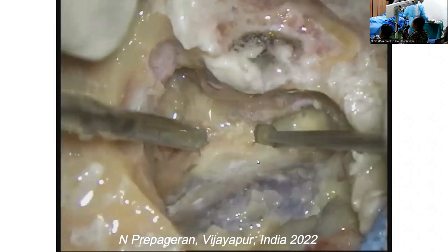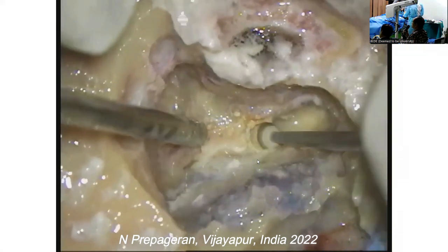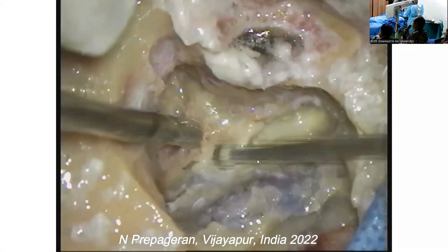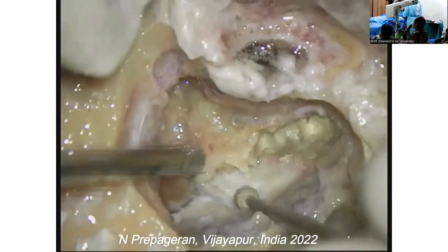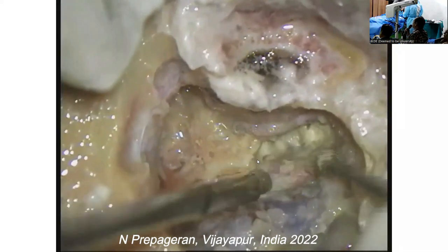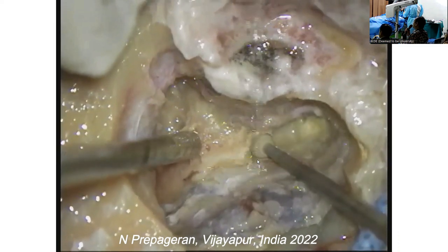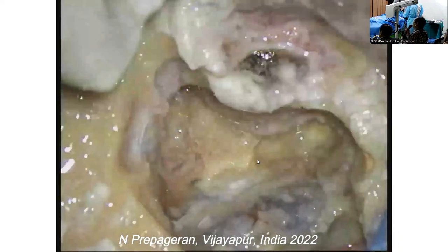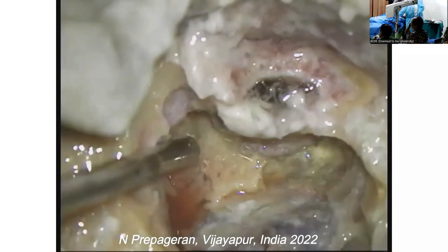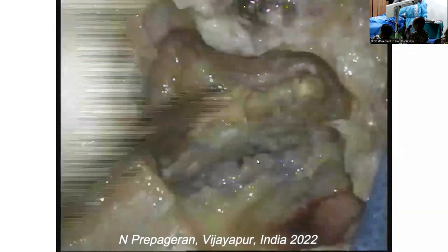So now I'm just going to dissect and drill off all this. Except near the dura or sinus, why can't we use the cutting burr? Anyway, we are doing mutilative surgery. Your cutting burr is kicking back, so it's very difficult to control.